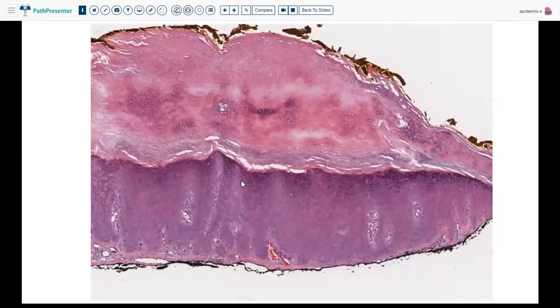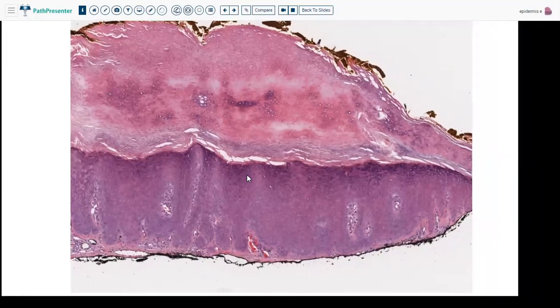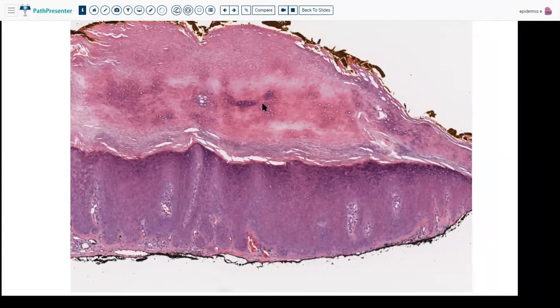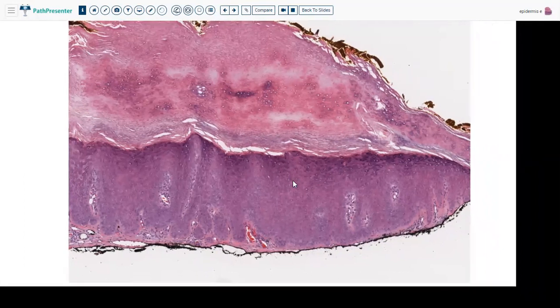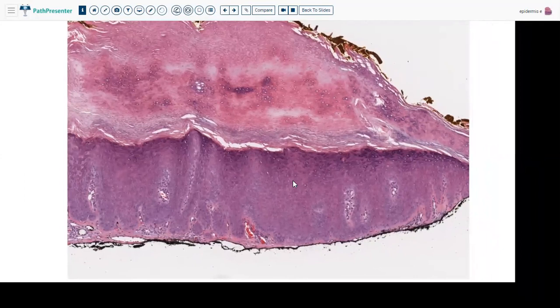Moving on to the next slide — this is more or less the same for another case showing hyperkeratosis. Here you can see thick, more or less basket weave hyperkeratosis, just to show you the difference between the two types.